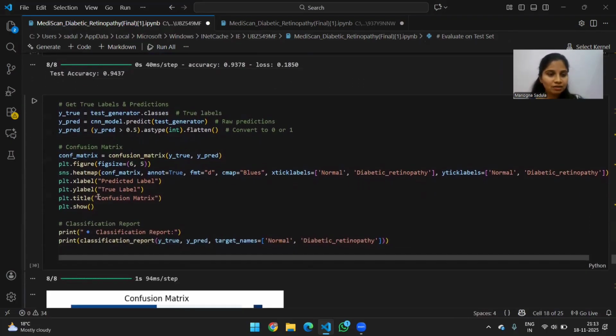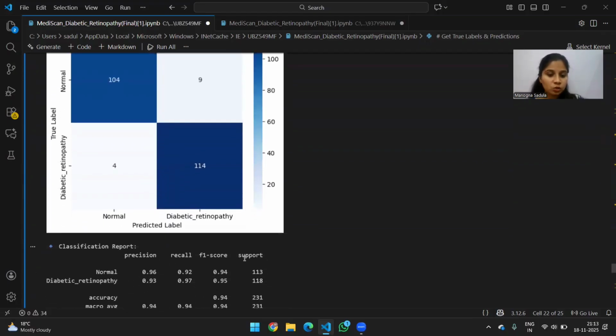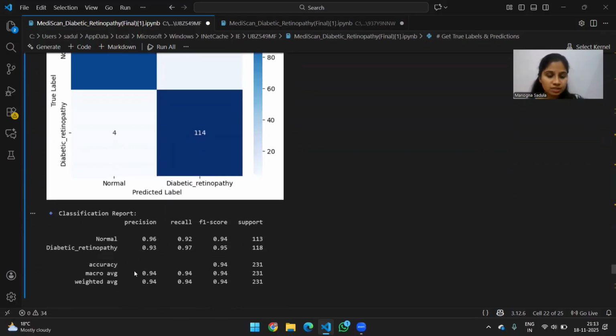Here is a confusion matrix and the classification report, which summarizes how well the model has predicted normal versus diabetic retinopathy. The confusion matrix gives us the correct as well as incorrect predictions, whereas the classification report gives us the precision, recall, F1 score, and the overall accuracy, where the model has performed strongly. The next part will be continued by my teammate Pavan.